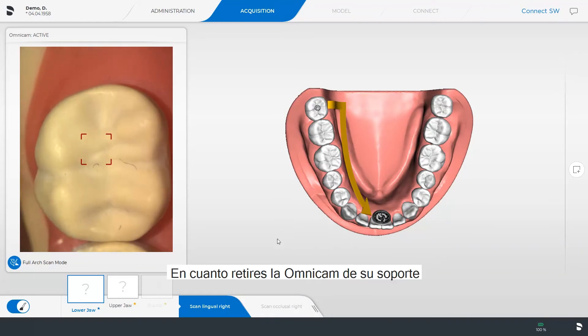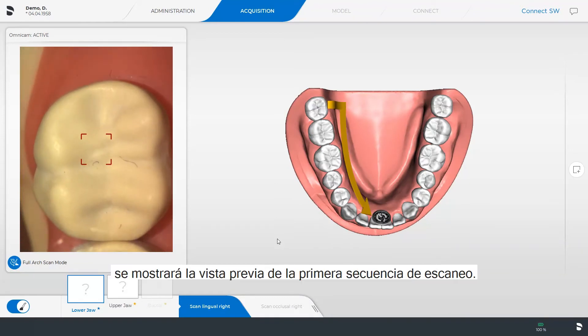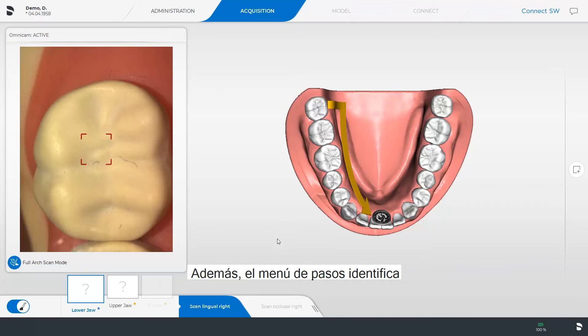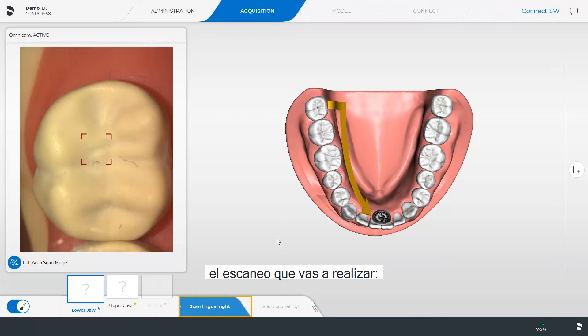Once you remove the Omnicam from its holder, the preview of the first scan sequence will be displayed. Additionally, the Step menu identifies the scan you are to perform: Scan Lingual Right.